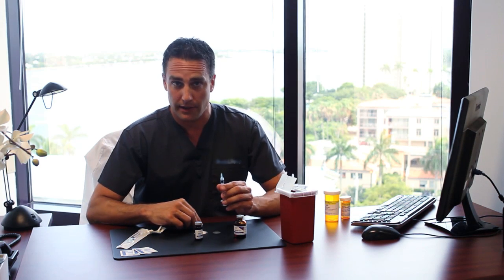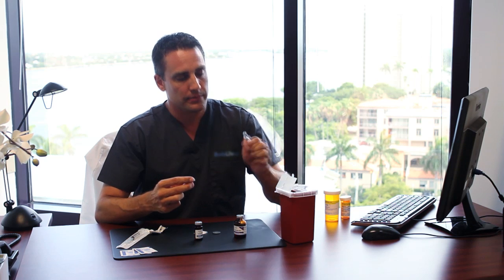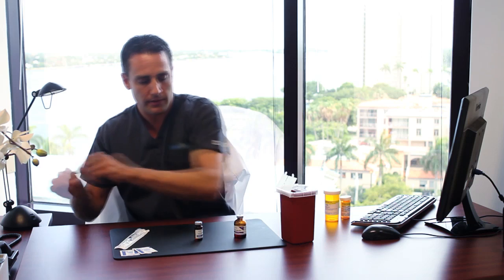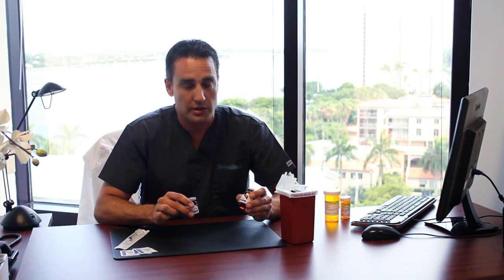Now that we've completed our testosterone injection, we want to go ahead and clean up the mess. Go ahead and put the protective cap very carefully back onto the needle. Unscrew the needle off the plastic syringe. Take that needle and dispose of that in your sharps container. The remaining plastic syringe, the caps, the covers from the medications, your alcohol swabs and paper can all be disposed of in the garbage. Please remember, these instructions apply exactly the same to both the B12, which is the Ultra Slim Shot, and the testosterone cypionate.